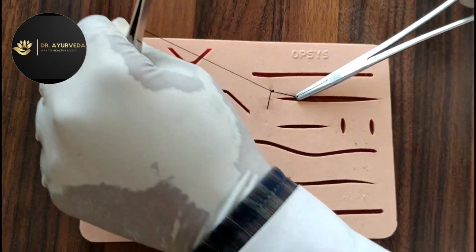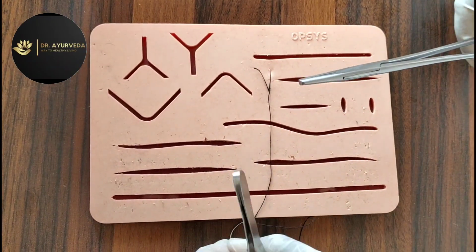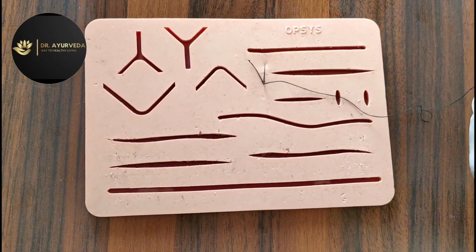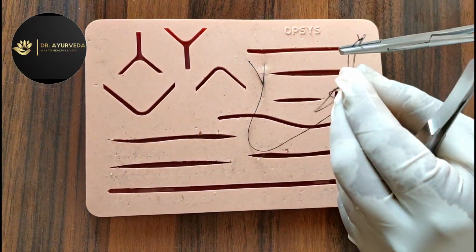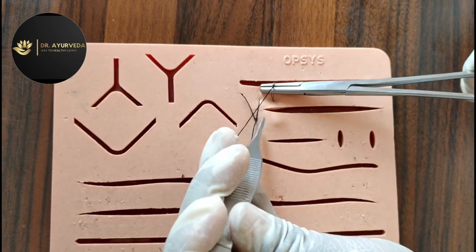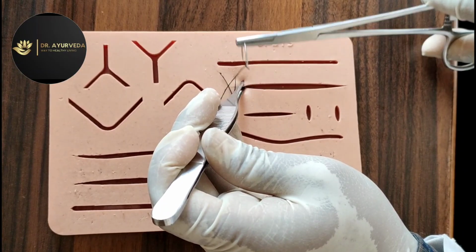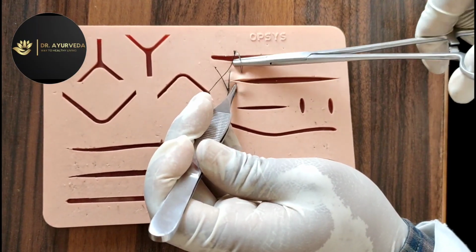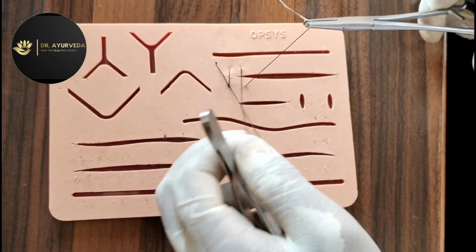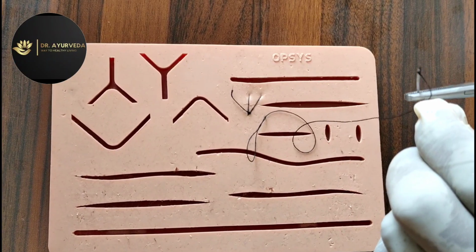Initially, a simple interrupted stitch is placed at one end of the wound. This suture is knotted but not cut. Simple continuous sutures are placed over the length of the wound, repenetrating the epidermis, and passed dermally or subcutaneously. It is important to place each stitch at equal distance in the simple continuous suture technique. The application is terminated by a single knot at the end of the suture line.